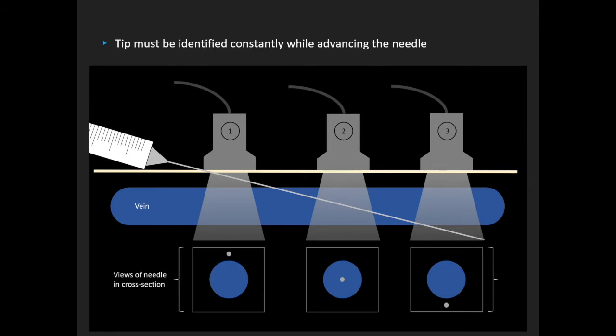Sometimes the needle shaft is misinterpreted as a target sign instead of the needle tip. To confirm the tip, the ultrasound plane can be fanned distal to the needle — the target sign should disappear and reappear once the ultrasound plane is brought back to its original location.